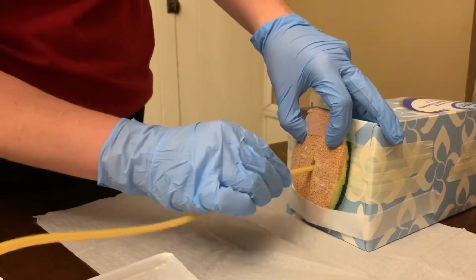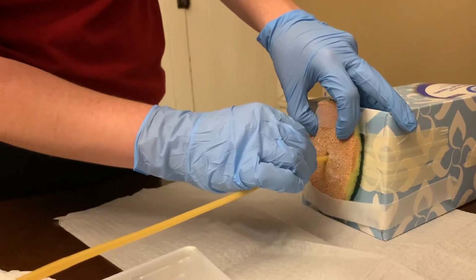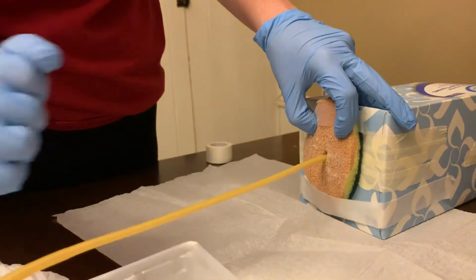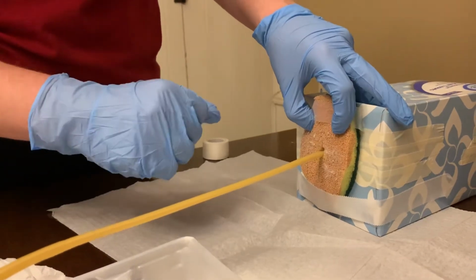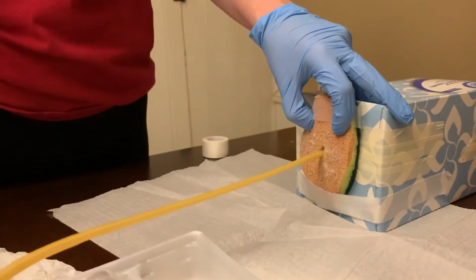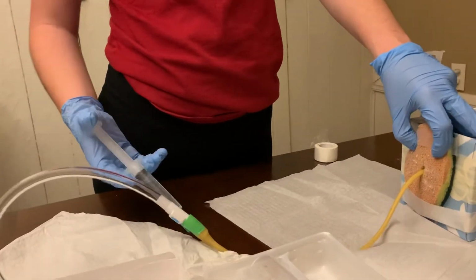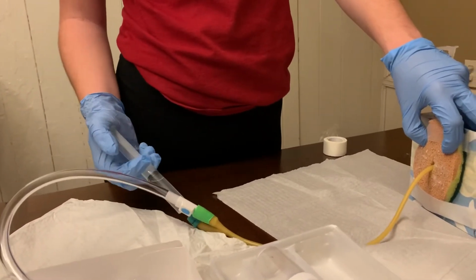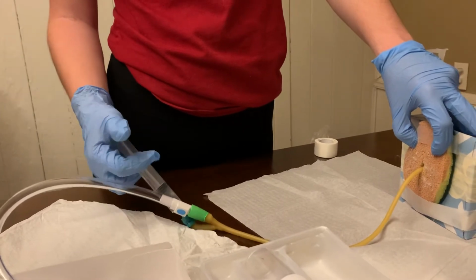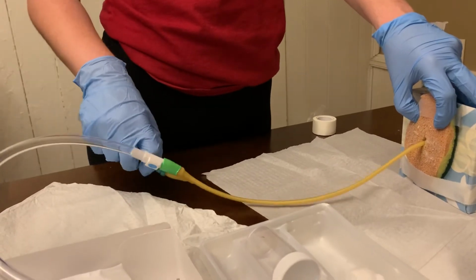Once I find the hole, I'm going to advance the catheter into the urethra until I see urine in the tubing. Once I see that, I'm going to advance it 1 to 2 inches further. After that, I'm going to take my sterile hand and insert my fluid to inflate my balloon. Okay, and I can disconnect that from my tubing and throw that away as well.